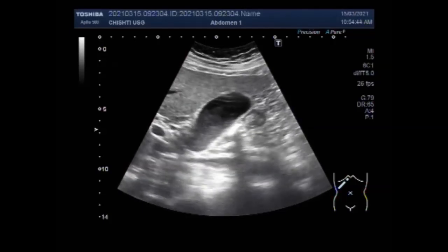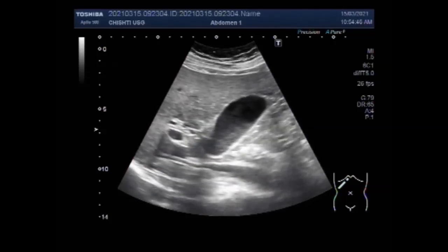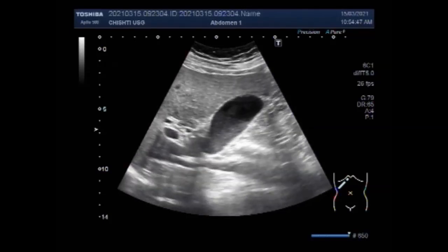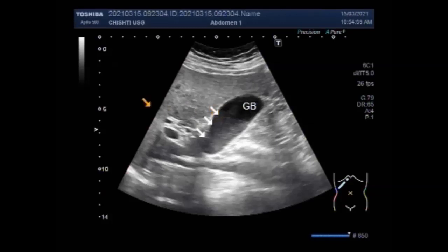Now you can see the gallbladder sludge seen in the dependent portion and the neck of the gallbladder. But if the posture of the patient is changed, it may pass toward the fundus of the gallbladder.